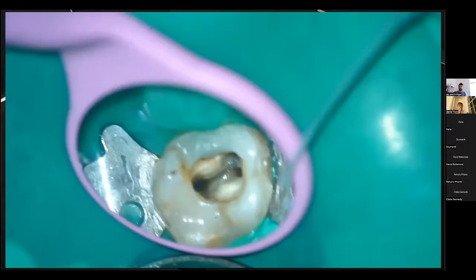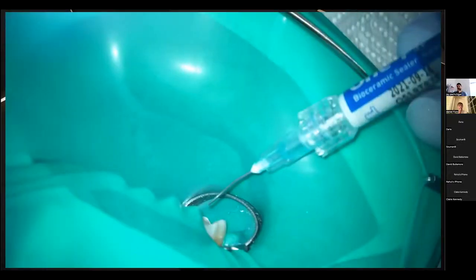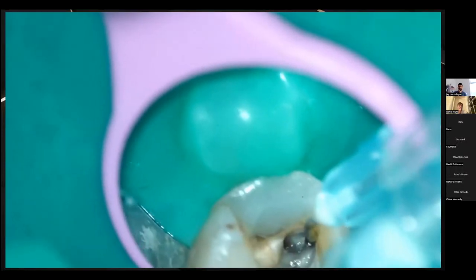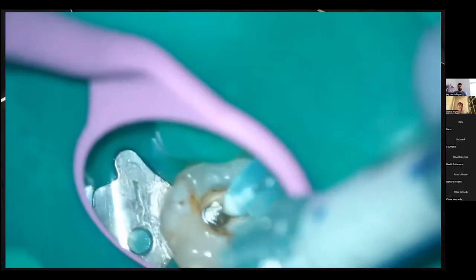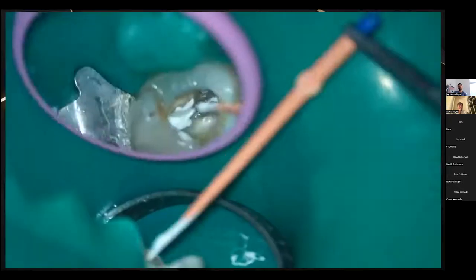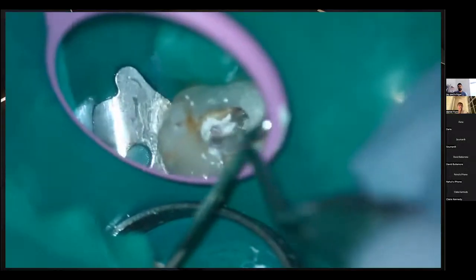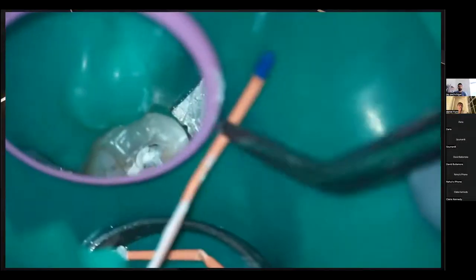So again, just another typical molar case. This is just an edge tip which I use as well. I bent that at 90 degrees. It's gone into the MB, coming out the MB2 here. And again, I'll inject that; it only really goes 1 or 2 mils into the actual canal. You get a bit of excess into the syringe tip there. And again, you just pump it to spread that sealer apically. Again, very little down pack here. You don't need to be going 5 mils from the apex.